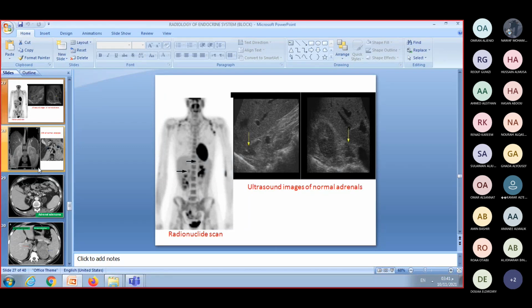We even have a term called PLISK, which shows us the arrangement of the echogenicity of the pancreas, liver, spleen and kidneys. Pancreas is more hyperechoic than liver in the adult, slightly hyperechoic compared to the liver.